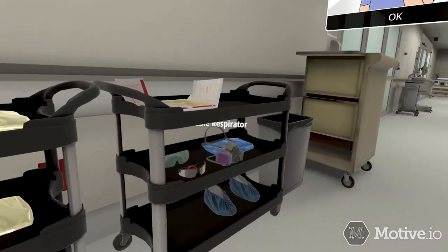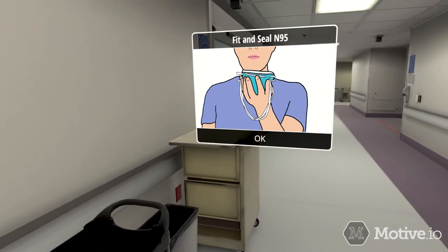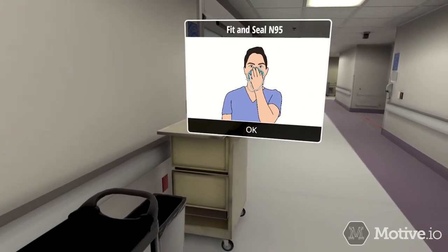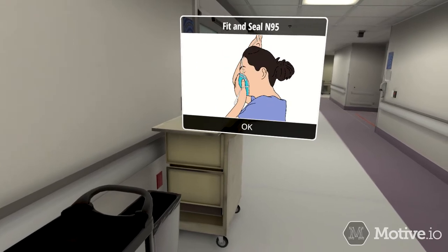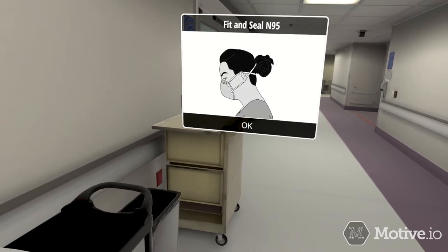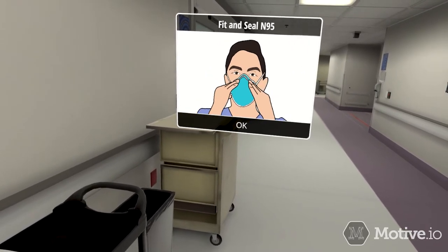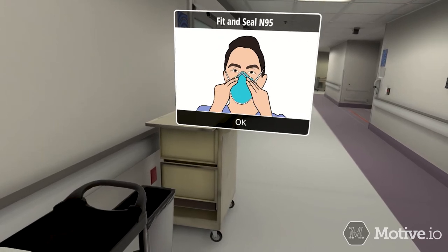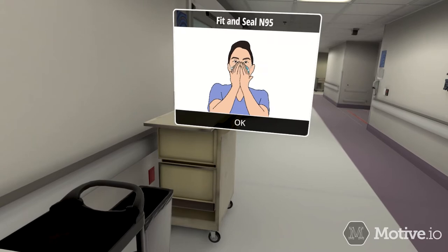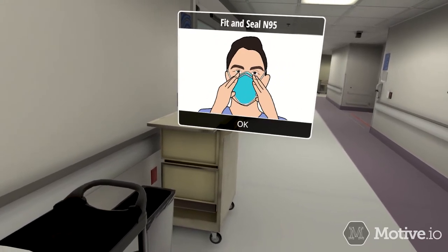Donning N95 disposable respirator: Cup the respirator in one hand with the nose piece at your fingertips, allowing headbands to hang freely below your hand. Hold the respirator under your chin with the nose piece up. Locate the upper strap across the crown of your head and the lower strap below the ears — straps must not be twisted or crossed. Using both hands, mold the nose clip to the shape of your nose to ensure a close fit and good seal. Cup your hands over the mask to check for air leakage; take deep breaths, and if you feel air on your hands, adjust the mask.